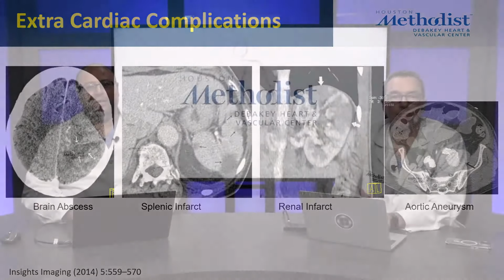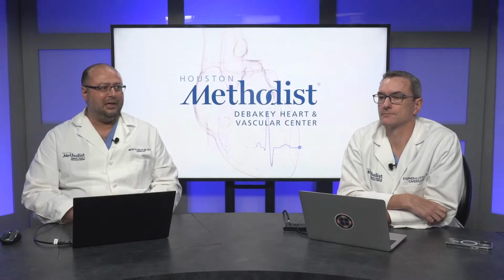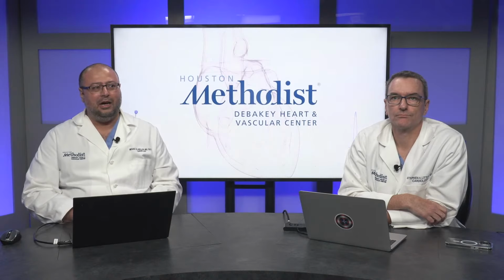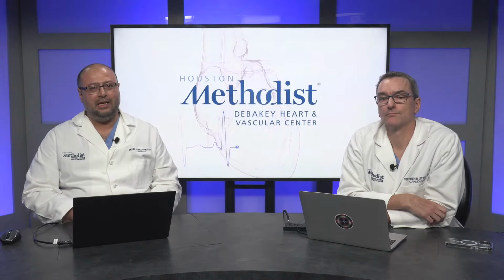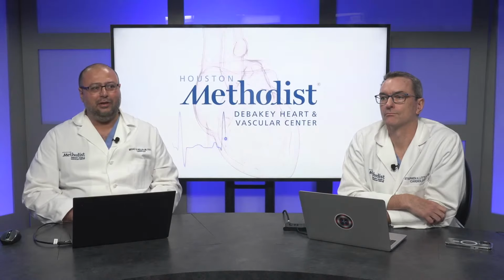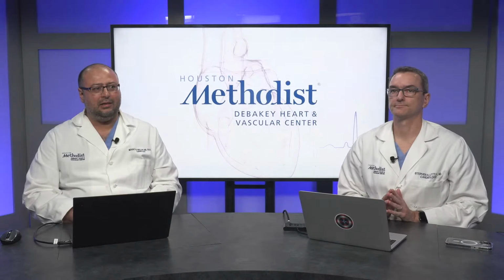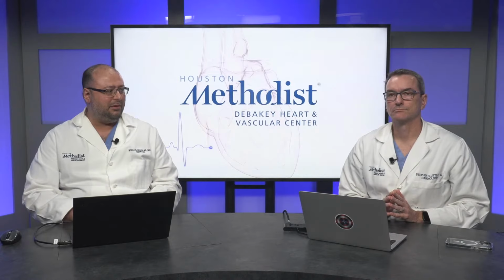And more often we are getting CT to assess the coronaries in a patient with endocarditis, and we identify further local advanced disease. But TEE and echocardiography with the advances, if you have good imaging windows, you are able to ascertain the diagnosis. But if you're contemplating surgery and there's a highly mobile lesion on the aortic valve, you want to assess the coronaries in the appropriate patient. You don't want to cath them, and this is where CT can add a lot of additional information.